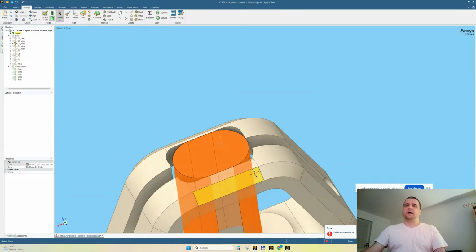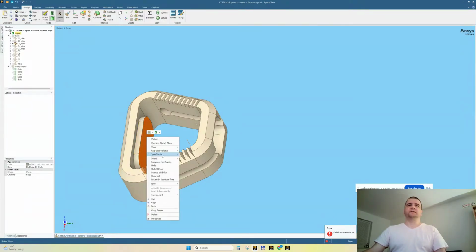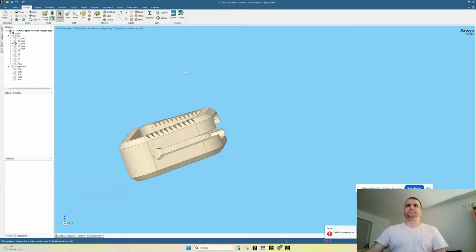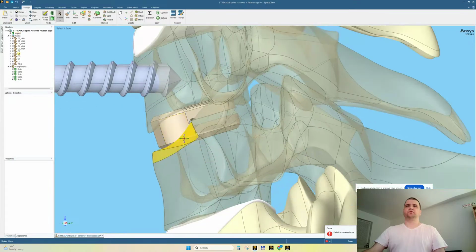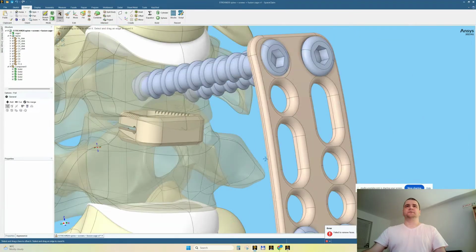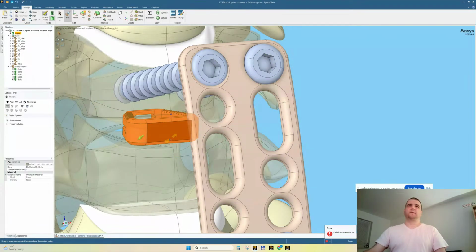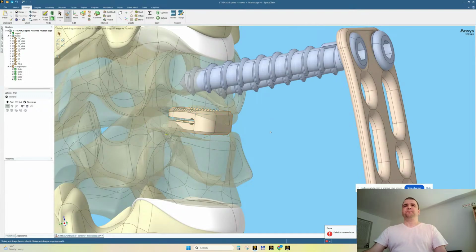So let's click these faces and hopefully get rid of this element. Unfortunately, I forgot one face. Delete. Very smart. Do I need this? I don't need this. Select protrusion. Delete. Now we have the proper spring. Show. It's still too much. Let's scale it again with 0.9 if possible. We pick an anchor point from here, 0.9. Another 0.9, and that's it.